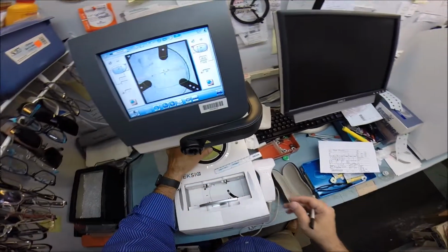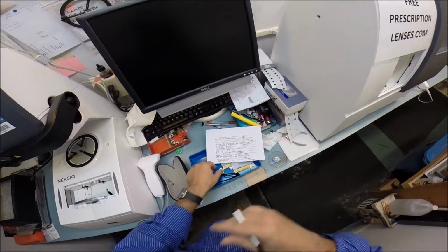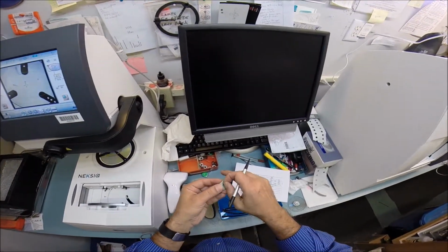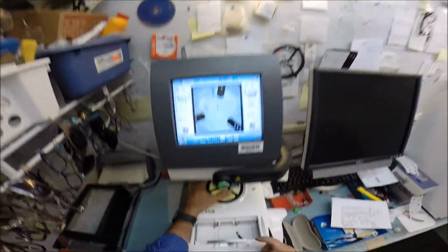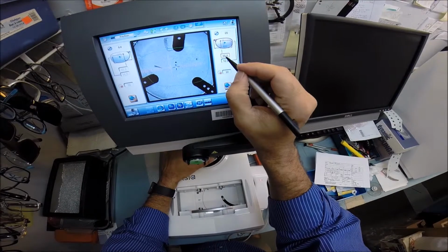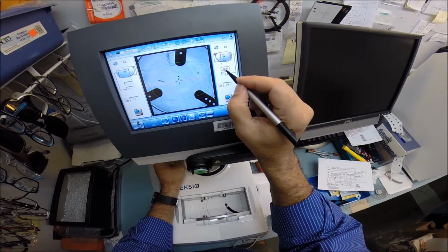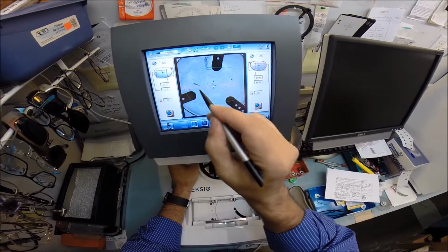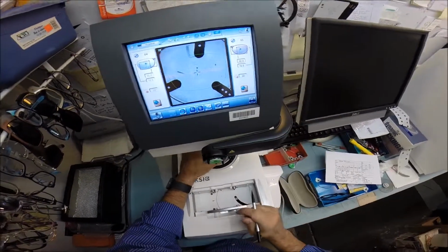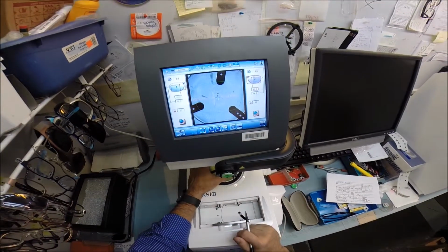Let's do the same thing for your left lens now. Get my PD stick out of the way. Pull the sticker off. Put the block into the arm. And it automatically doubles for the left eye. So we're getting it switched to the left already. That is the shape of the left lens. It sets it to 30 because it just mimics what happens on the right.